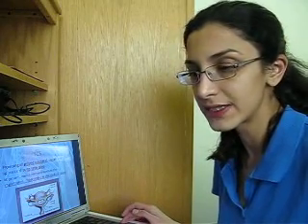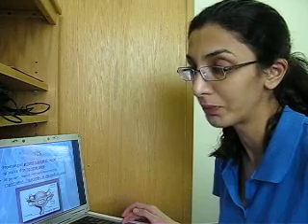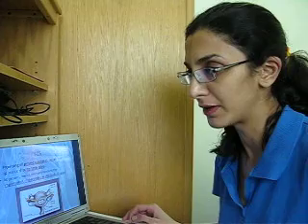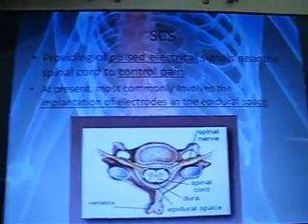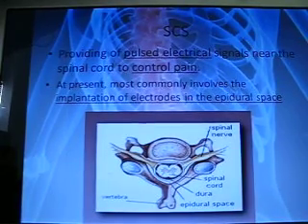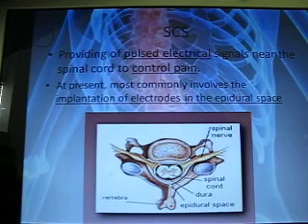Spinal cord stimulation provides an electrical signal to the spinal cord to control pain. Nowadays, the electrodes of spinal cord stimulation are implanted in the epidural space. I have plenty of pictures here, let me show you them. Okay, so this is the epidural space, the target place of the electrodes.